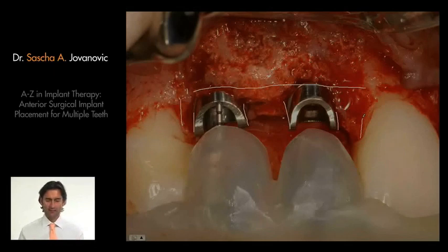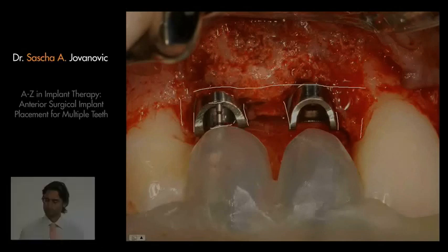I place the implants in the optimal implant position. You can see that here. This is the implant neck. This is the gingival margin, which we're trying to create. And so you can see how the implant was placed 2 millimeters below the gingival margin. But now I'm showing titanium surfaces. And I have a problem with the interproximal area not having sufficient tissue between the two implants.